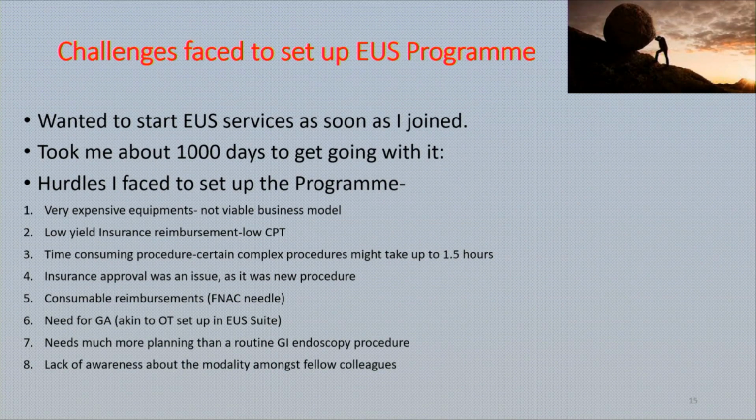Then you need expensive consumables for this, because when we put a needle into a tumor, as per the international safety standard, you cannot reuse them. So these were the hurdles to set this up. Then you need a GA setup, an OT kind of setup, because this procedure takes much longer. It can take half an hour to 1 hour, so the patient has to be sedated. Then there is need for more planning to do a procedure.